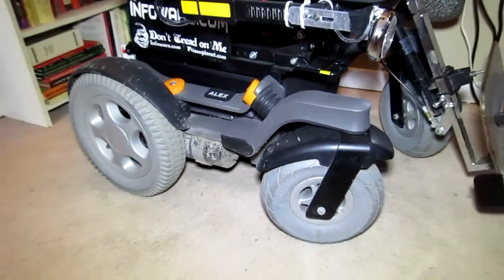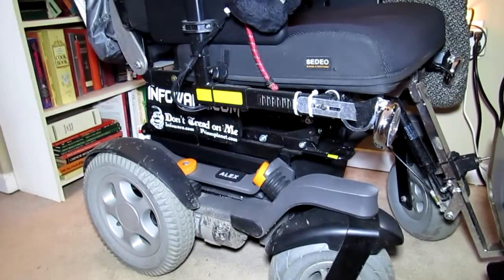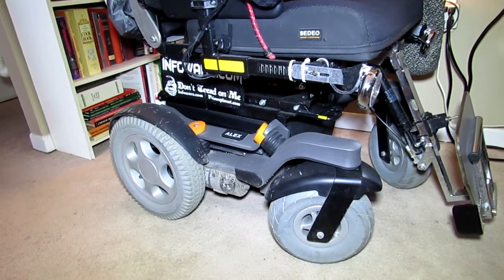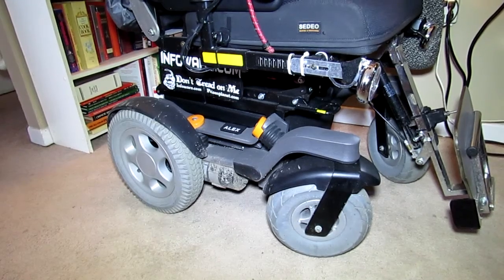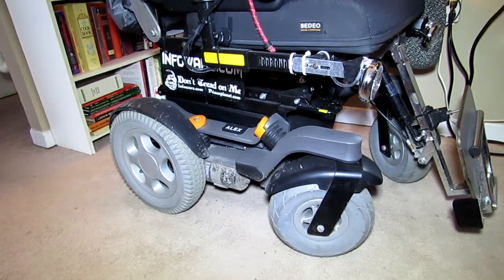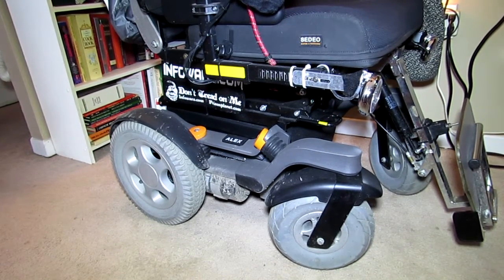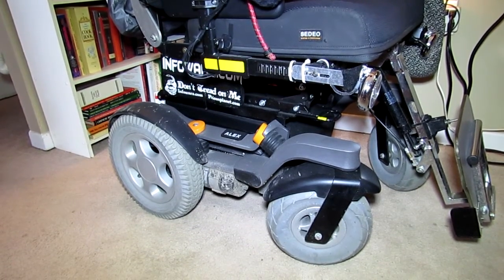We have serious design flaws in this chair, and there are other problems I'll cover in another video. One of the reasons this is happening is because unlike Europe and the USA, Canada has no rules, regulations, licensing, inspections, or certification — accountability doesn't exist. You become disabled and you're on your own. I fought for years to get this more modern wheelchair so I could ride without horrific pain. I have a broken spine with my T8 vertebra compressed by 90%, which means I'm essentially in two pieces. Being violently jolted could sever my spinal cord and leave me paralyzed.